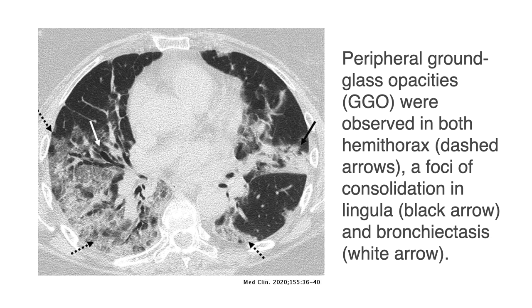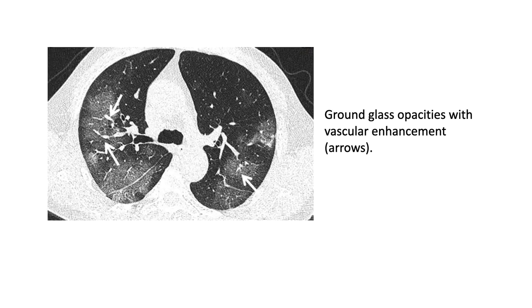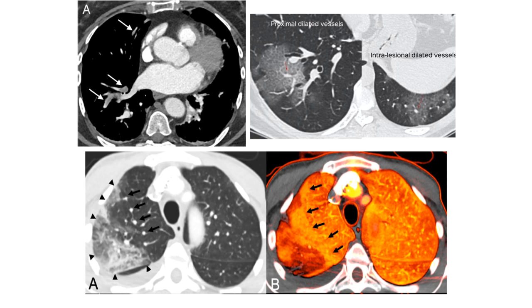Another example of ground glass opacities: a solid black arrow showing lingular consolidation on the left side, a white arrow showing bronchiectatic changes, and a broken arrow showing ground glass opacities in both hemithoraxes. X-ray and CT comparison of the same patient at the same stage: the left image shows diffuse reticular alteration, the middle shows peripheral ground glass opacities, and the right shows dense extensive consolidations. Another CT shows ground glass opacities with vascular enhancement and dilated vessels.